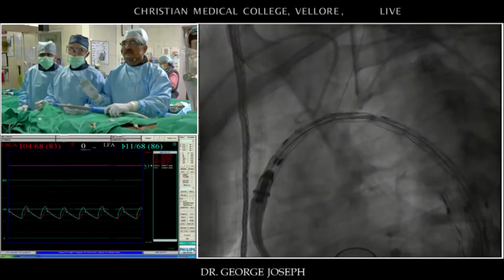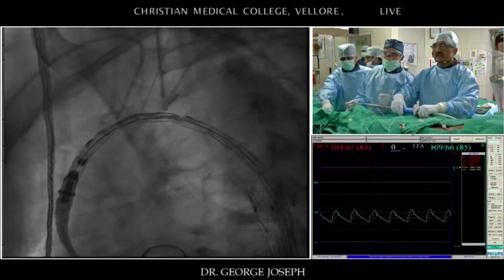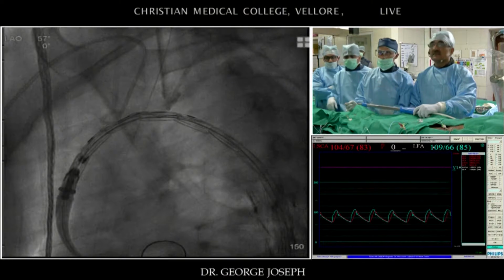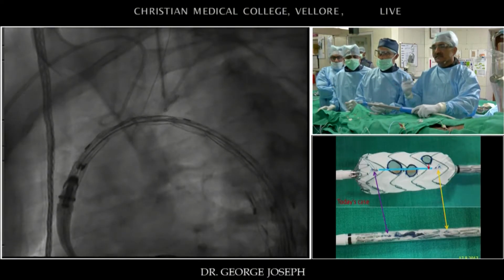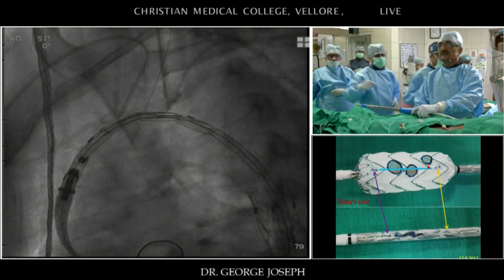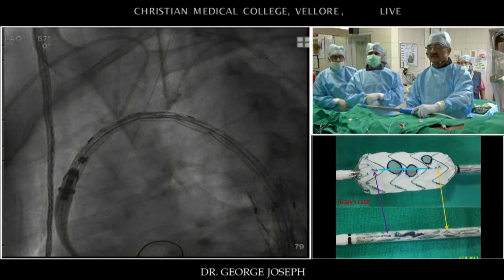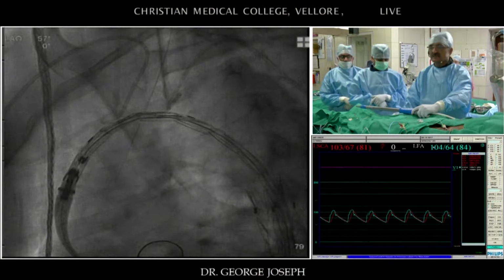Do you do an angio through the innominate to confirm that it lines up okay? You want to inject in the innominate? You can just inject a little contrast into that? No, I mean, you don't have to if you're comfortable. We're just asking what your technique is, whether you routinely do innominate angiograms. Yeah, no, actually it's okay.